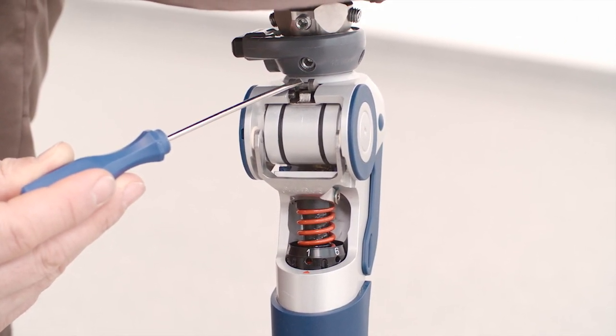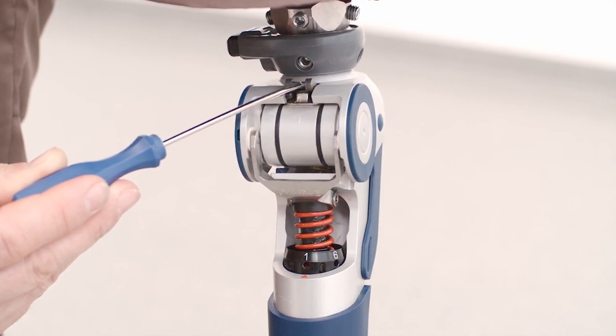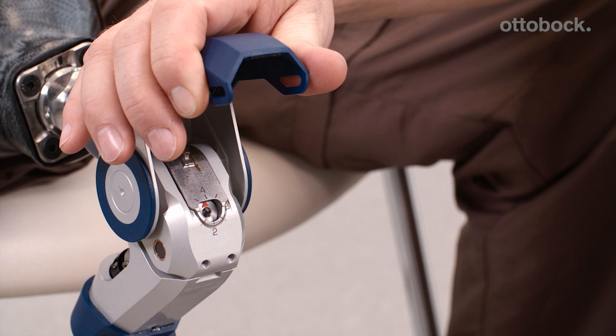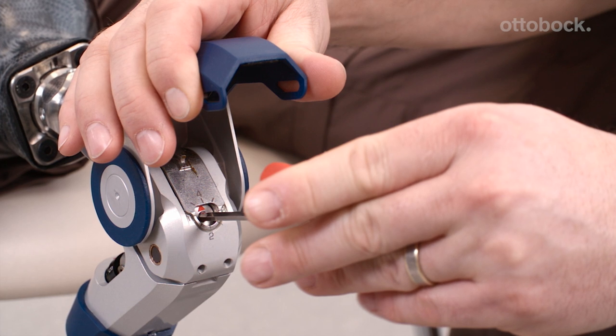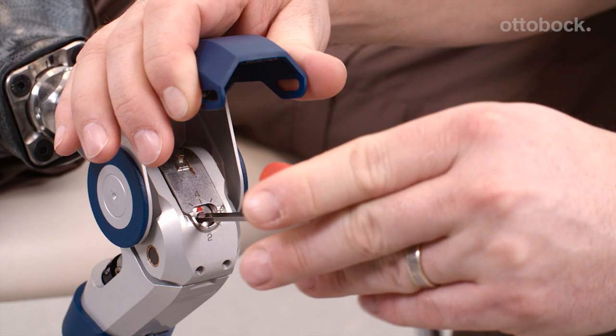As you can see here, the locking function was disabled in advance due to the higher activity level of the patient. The sensitivity of the brake is set in such a way at the factory that it generally doesn't need to be adapted to the patient. The adjustment screw is set to level 4, which means the highest brake sensitivity when the prosthesis is delivered.